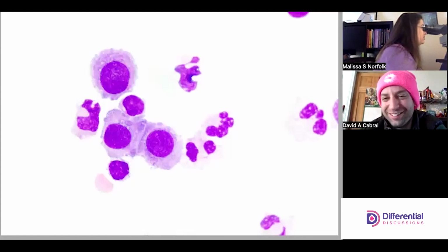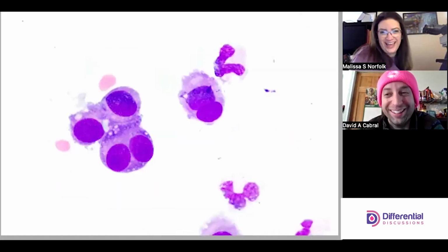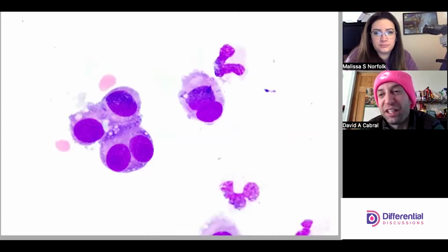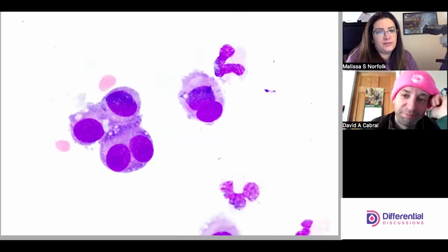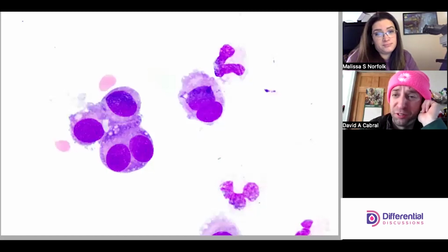All right, I'll move again, just one more time, see what we find. Just more mesos. That's a lot. Sometimes when you're not actively counting, it's probably almost definitely over 30%, maybe 50% are mesos. It's a lot. And this meso, look, it's large, not as large as that big ugly one we saw at the beginning. It's got two nuclei, which is not concerning. A huge prominent nucleolus in each one of them, too. It's beautiful cells.